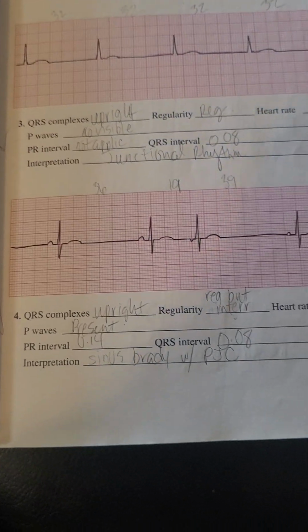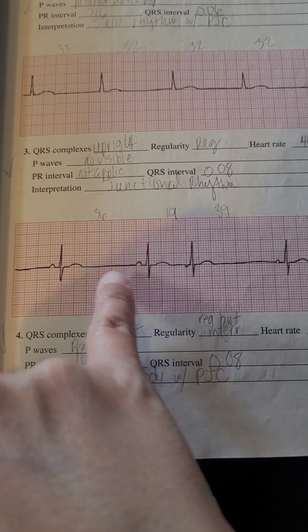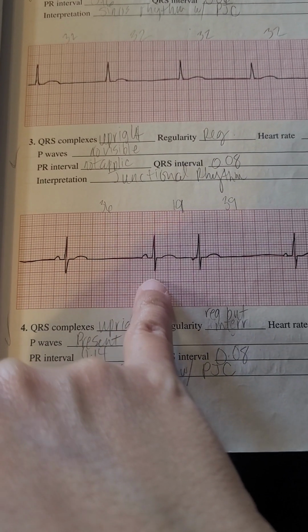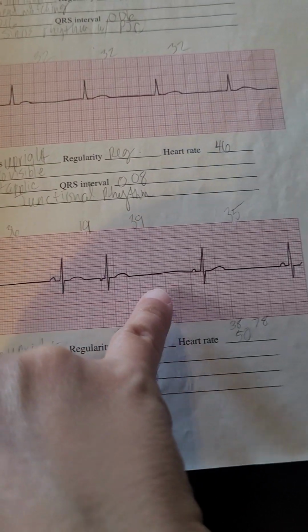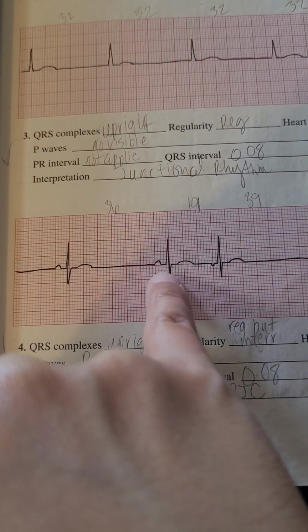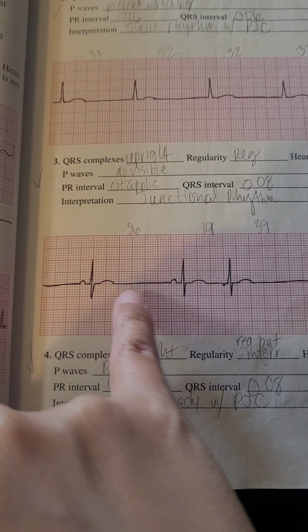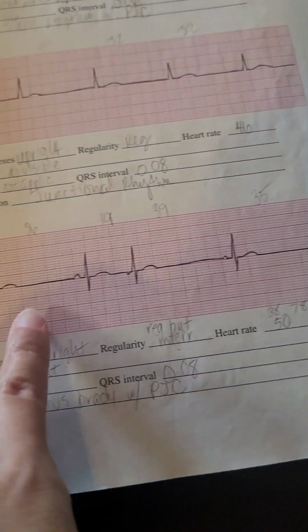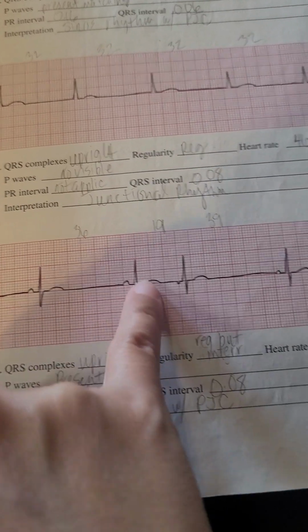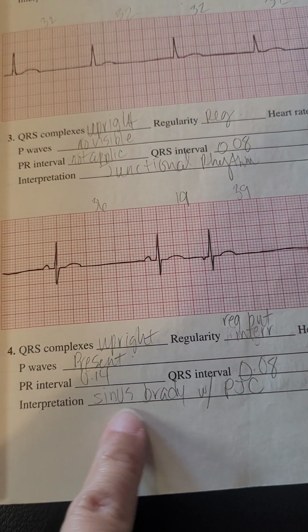Let's see what this is in the bottom. So it's beating slow. This heart is beating slow. 1, 2, 3, 4, 5. It's a sinus. It's just beating slow. So what's a sinus rhythm that beats slow at 1, 2, 3, 4, 5? Sinus Brady.